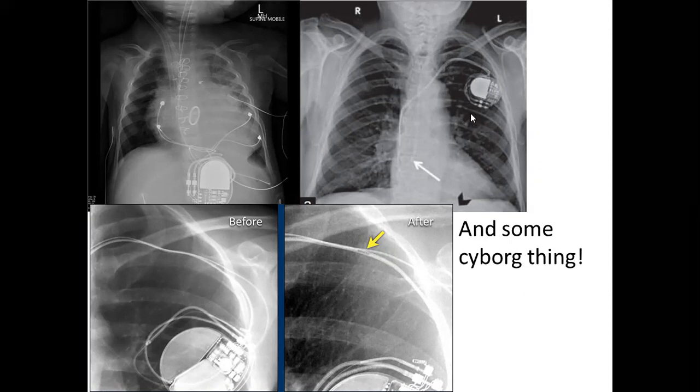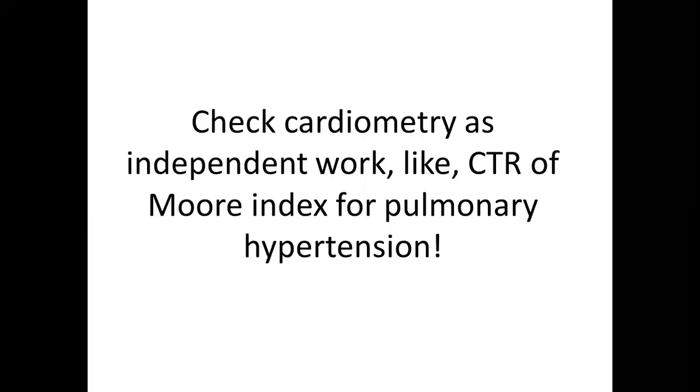In terms of defibrillators, we should also check how the wires are connected, because sometimes we may have dislocation, sometimes injuries and ruptures of these wires, and if this apparatus is not working when it is necessary, again, the patient may have myocardial infarction.